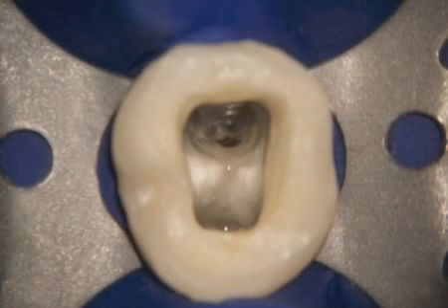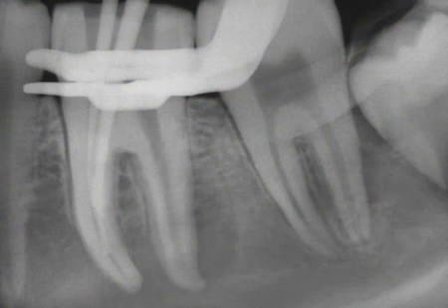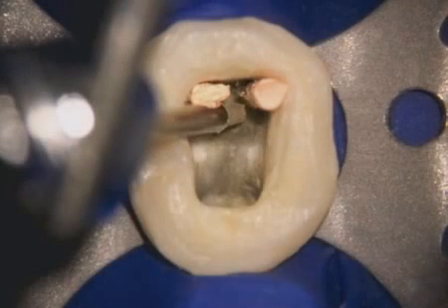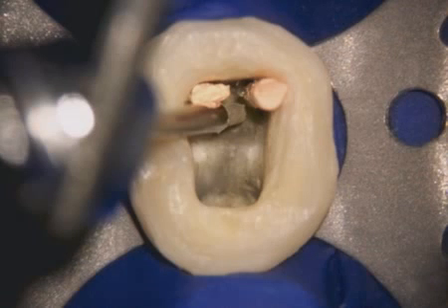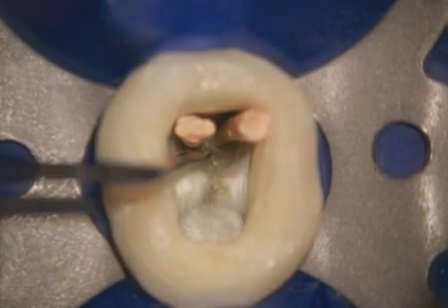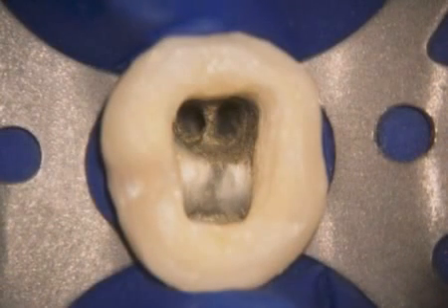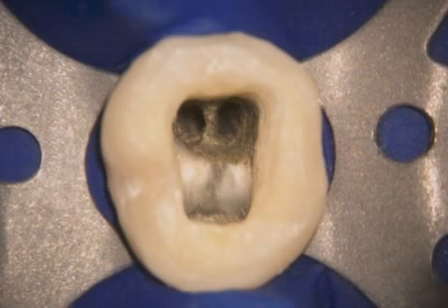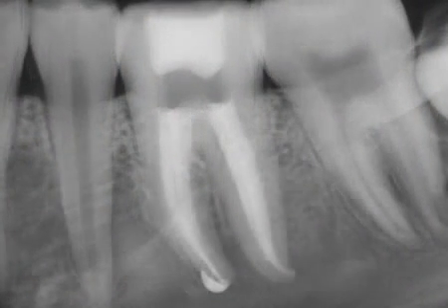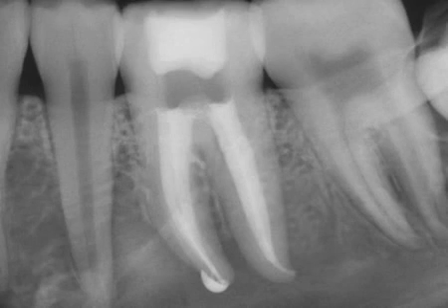Once the bleeding was arrested, gutta-percha cones can be placed apical to the defect to hold the positions of the canals. Currently, the material of choice for these types of repairs is MTA. It's introduced with a modified spinal tap needle. Controlled aliquots of material are inserted. Ultrasonics vibrates the material densely into place, and on a subsequent visit the gutta-percha is removed, and now master cones are fit following canal preparation in order to pack in 3 dimensions. Notice the compaction and the control of the material. The off-angled film demonstrates the anatomical form of this root canal system.